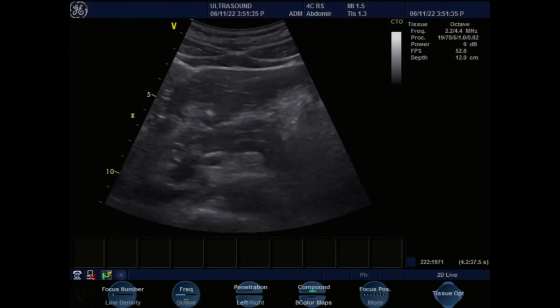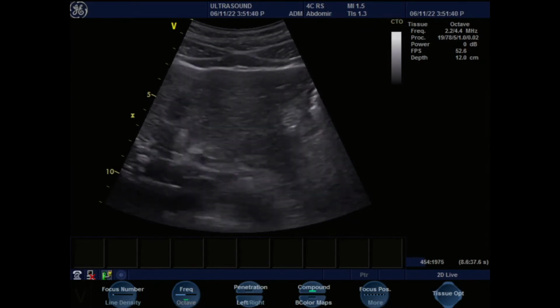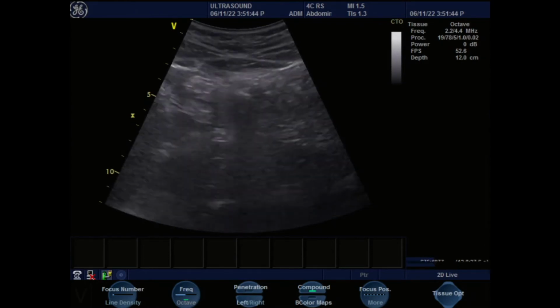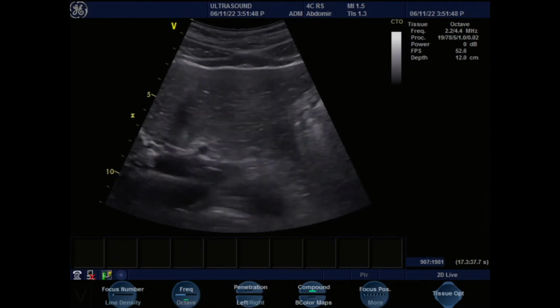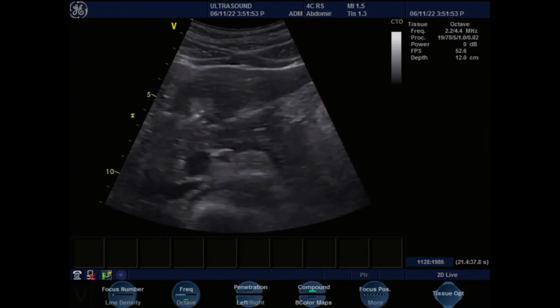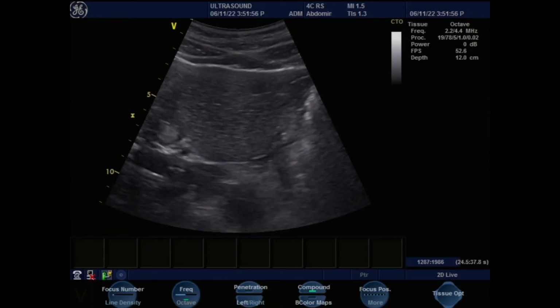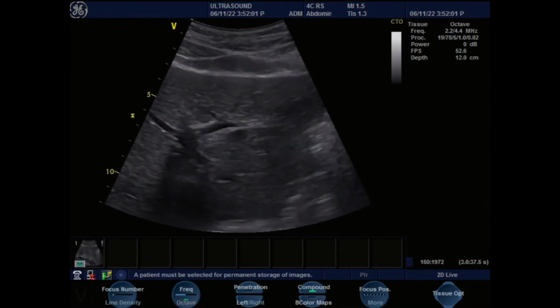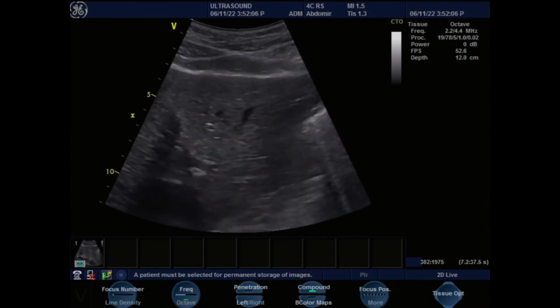We can do that, or I can quickly go over to the gallbladder and then we can practice pancreas and gallbladder at the same time. So I'm turning my probe. This was transverse pancreas right there. It's beautiful. Exam to identify pancreatic lesions? Pancreatic mass, yes, but they're very hard to see because they're small, like microadenomas. But mostly for distal ductal dilatation and choledocholithiasis.